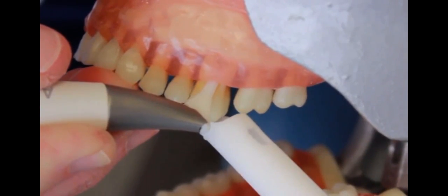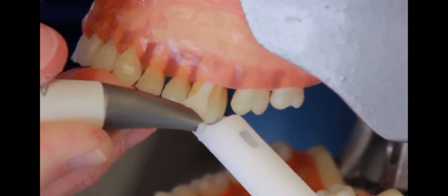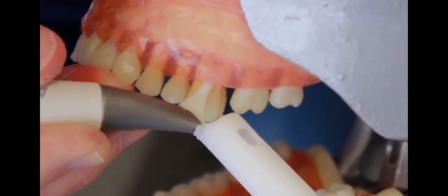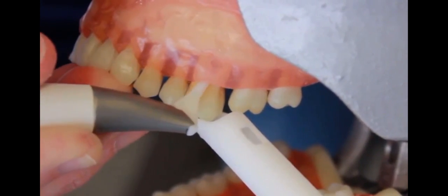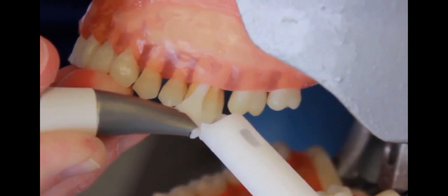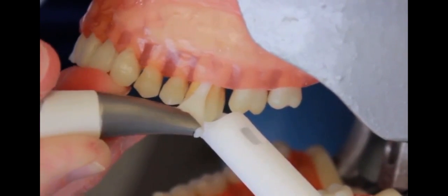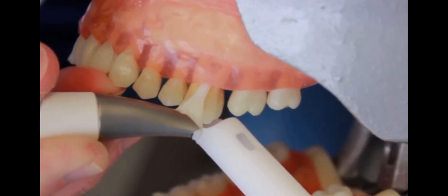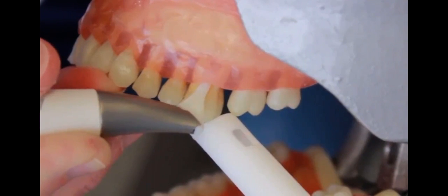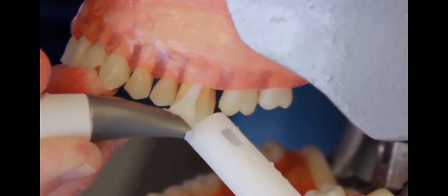Once we reach the base of the pocket, we want to make sure that we withdraw the tip about a millimeter. You can move this tip in a vertical motion, but never a horizontal motion. The powder is expelled from the sides of the tip and the water comes out the end of the tip. We're only going to treat each site for five seconds — I'll hit the treadle, five seconds to this site and stop.